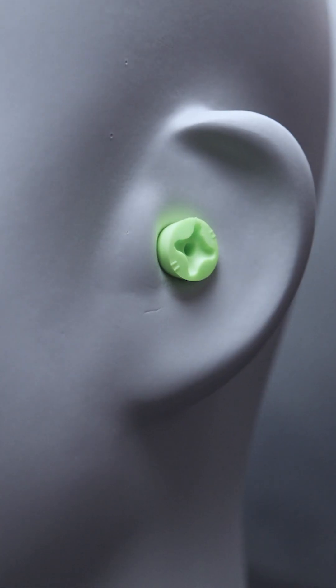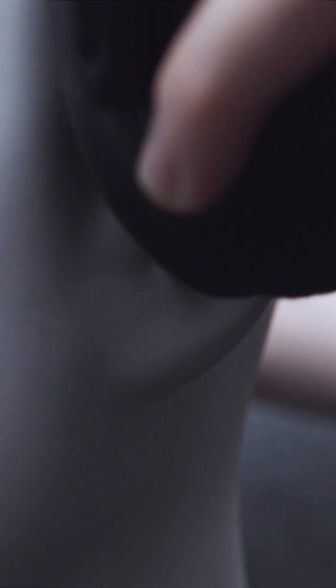We perform a REAT test, which means Real Ear Attenuation at Threshold, on both ears at the same time. We are using the hearing threshold as the reference point. We do one test without and one test with the plugs inserted. The difference between the two tests is the individual result: PAR, Personal Attenuation Rating.